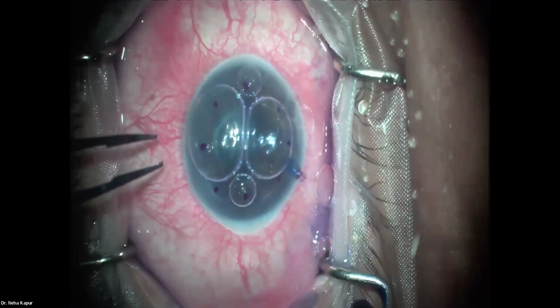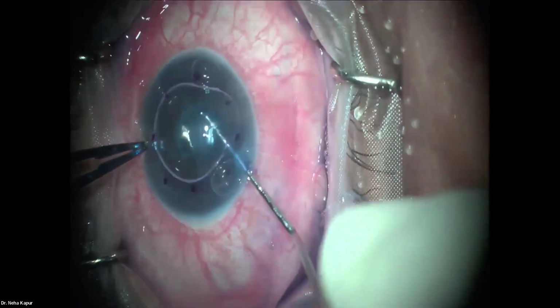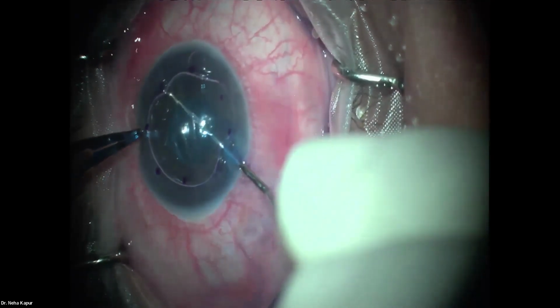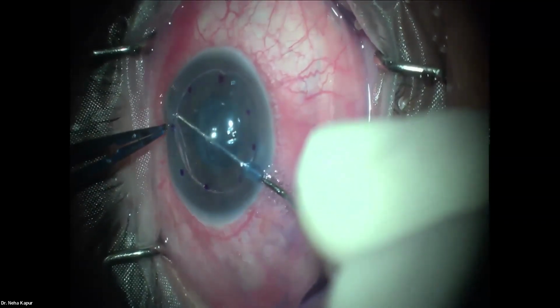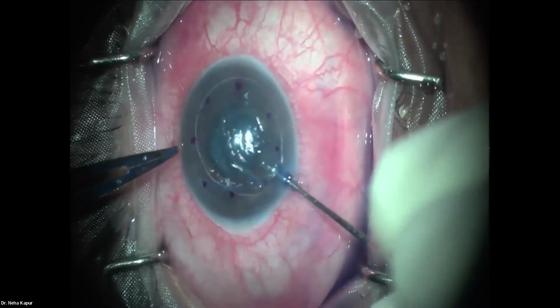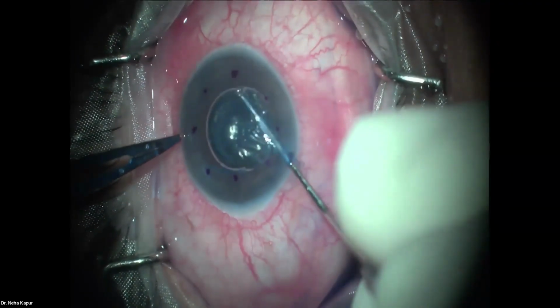And we have the mark where we would like to place the tissue. So stabilize with the limbus. We go in and score the DM just outside of this mark. And then start bringing in the tissue 360 degrees.